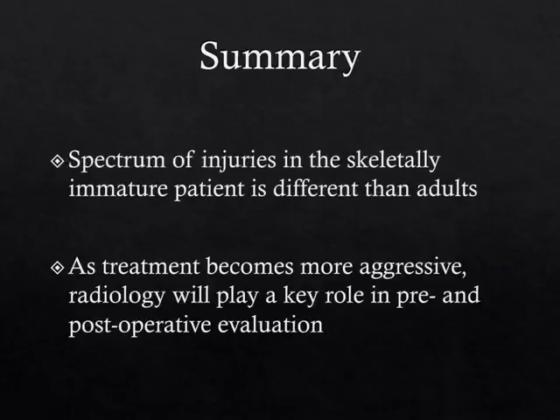So, sorry, I ran a little bit over, but hopefully you got a sense of the types of injuries we see out there, and as the treatment continues to evolve and become more aggressive, radiology will continue to play a role in the evaluation of these patients.